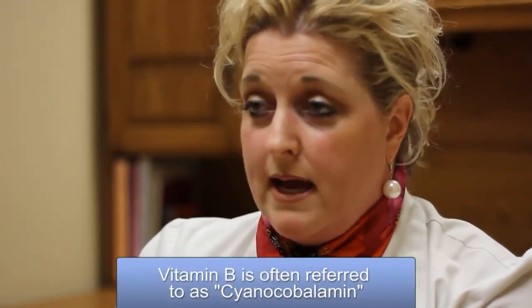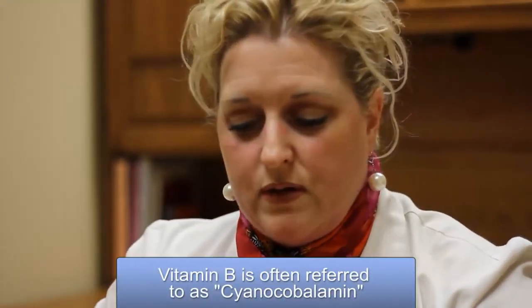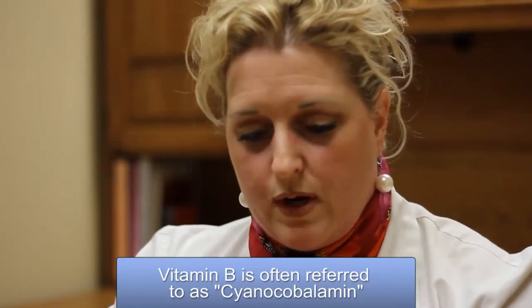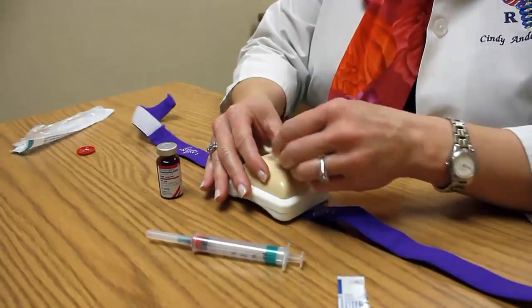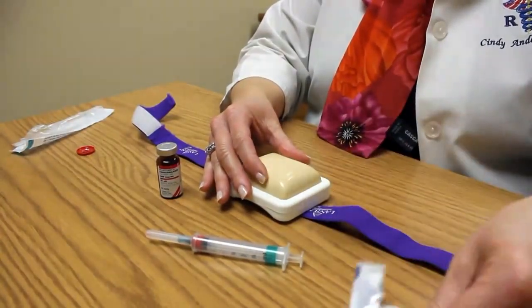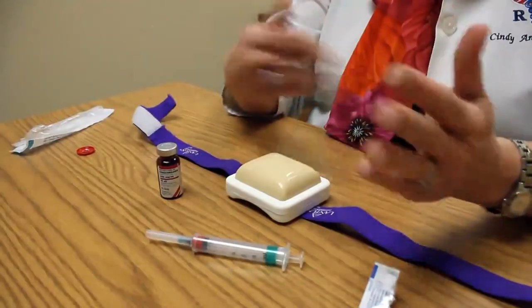You will always focus on the 1. You will have your vial of vitamin B12, and on your bottle it probably will not say vitamin B12 — it will say a long, difficult name, and it's called cyanocobalamin. Go ahead and prep the skin; you can practice with your orange. Take your alcohol and clean just the surface of the skin, just rub it a little bit. You might want to fan it or let it dry, because sometimes when you inject the needle into the skin it might cause a little stinging or burning from the alcohol, not from the medication.